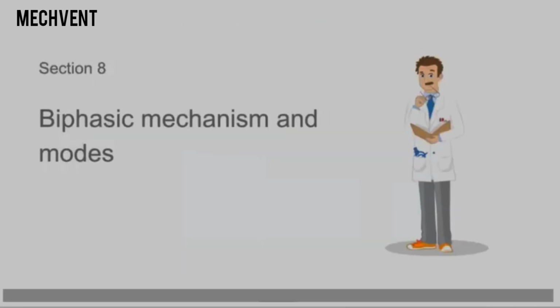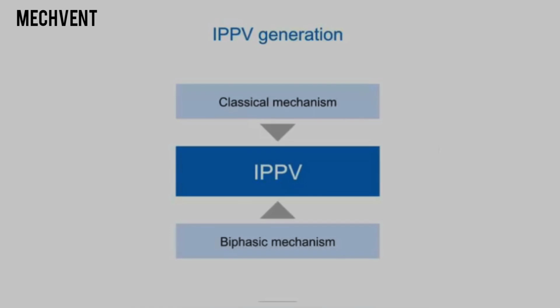Biphasic mechanism and modes. Biphasic modes are the third mode category. Before talking about biphasic modes, we need to learn biphasic mechanism. Mechanical breaths, the basis of IPPV, can be generated in 2 ways: classical mechanism or biphasic mechanism.